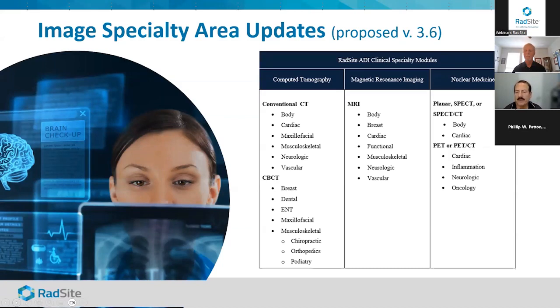And we talk about field strength, but really, if we have really well-defined physics parameters, we can rely on the true experts, the physicists, with regard to what are the parameters that we should be utilizing. And for me, I think if a lower field strength MR system is able to produce images utilizing phantoms that are comparable to higher field strength systems because the imaging time is longer in a protocol, or because they're using AI, convolutional neural networks, or other advanced reconstruction techniques that are constantly emerging.